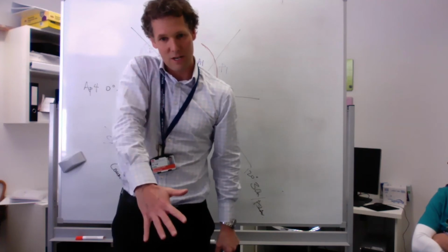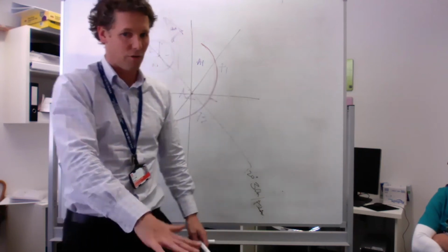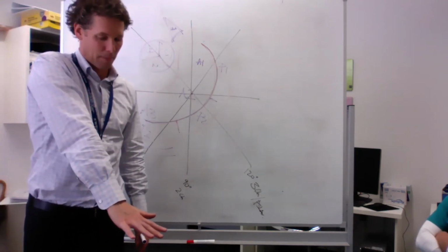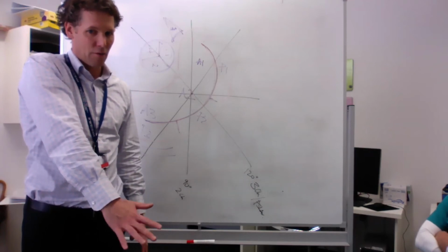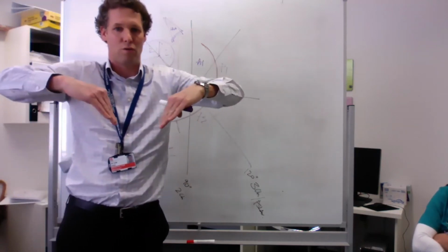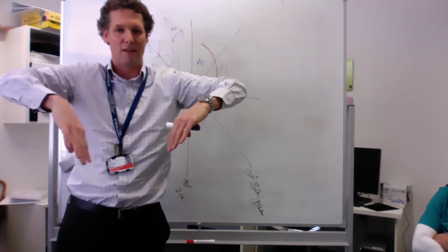Then 0, 60, 120, it's your thumb rotating round. As I come in, apical 4-chamber view, there's a bit of a retroflexion. That gives me anterior posterior. Then I'll rotate around to 60, 90, and I look for that leaflet where you get the two posterior, P1 and P3, and then you've got the A2 in the middle.